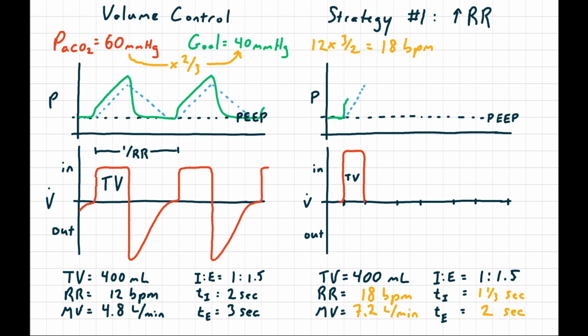Our circuit pressure will remain the same delta above the pulmonary pressure to continue to drive constant flow inspiration. When we cycle to expiration, the circuit pressure will return to PEEP as the expiratory valve opens. But how does expiration behave in terms of pulmonary pressure and expiratory flow? This is deceptively easy to figure out.